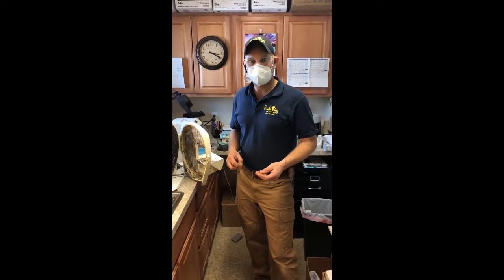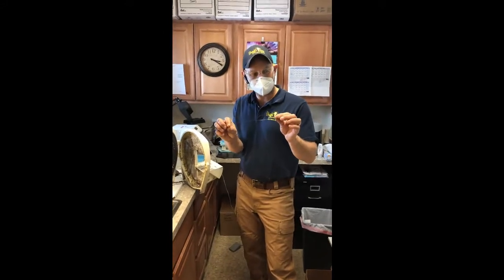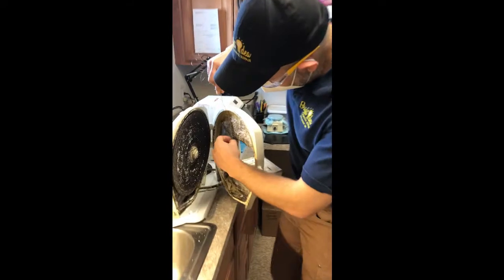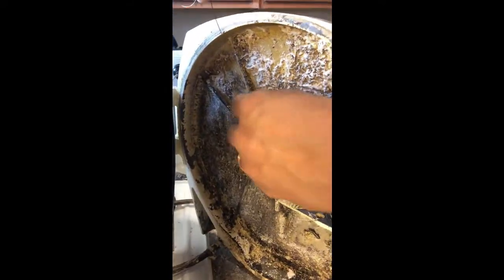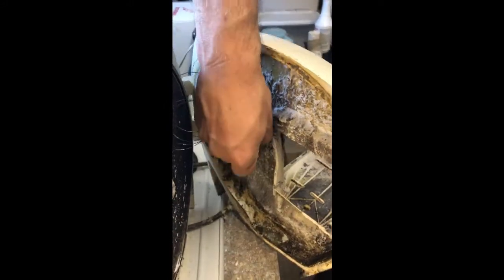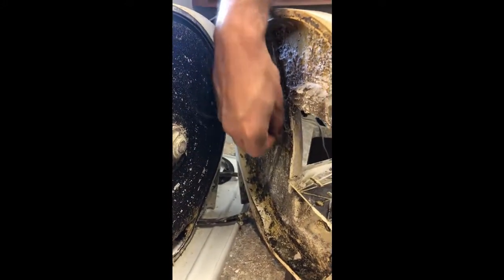All right, now that we've cut the top off of the tube here, we're going to use our nitinol cleaning wire to go down there and see how far the blockage is and see if we can actually clear it. So we'll put that wire in there. This nitinol wire is great for dental applications because it is very sturdy. All right, so we're cleaning that out right there.